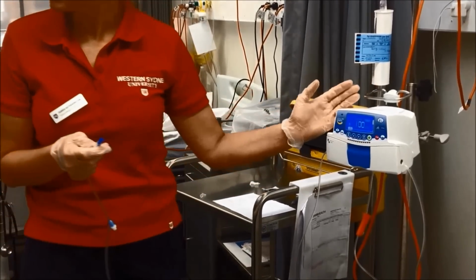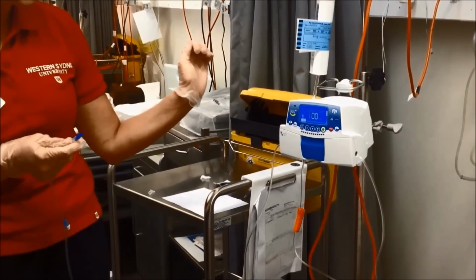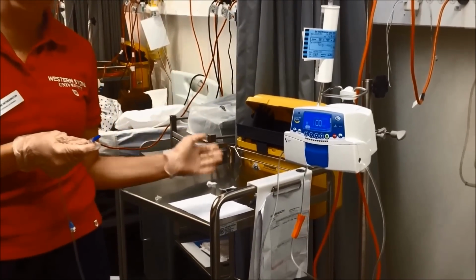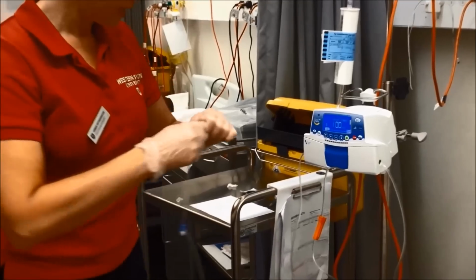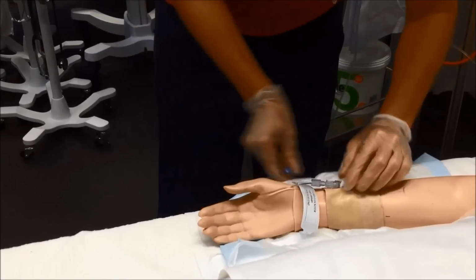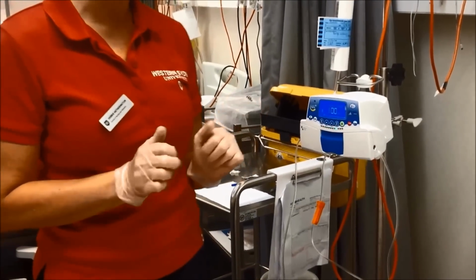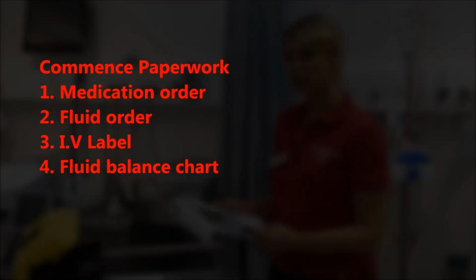I'll just get you to check my pump for me. 100 mils, going over 100 mils an hour, and then I'll change it to the rate that's on the IV fluid. Okay, now I'm going to connect. Okie doke. Okay, now I'm going to start. Excellent. Now I'm going to clean up and do my paperwork.